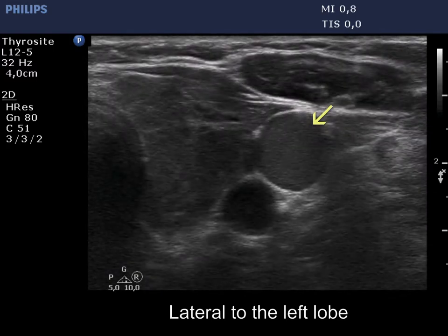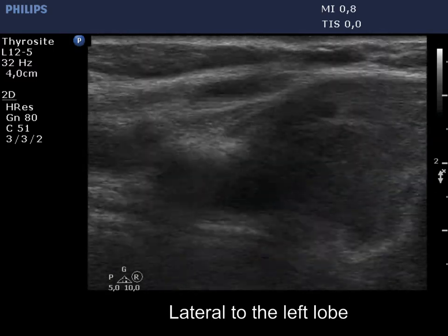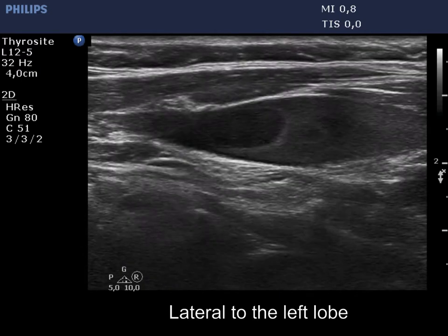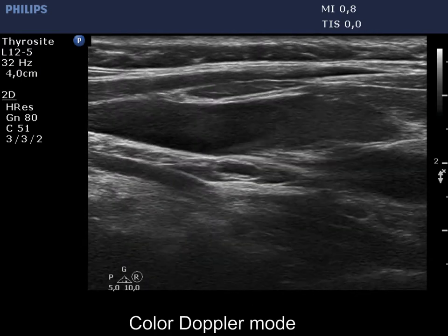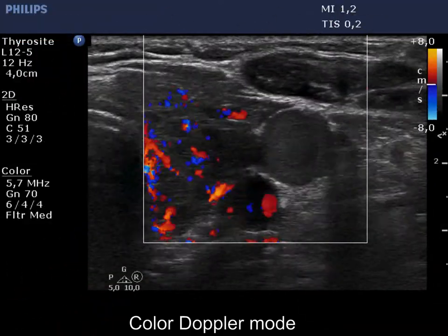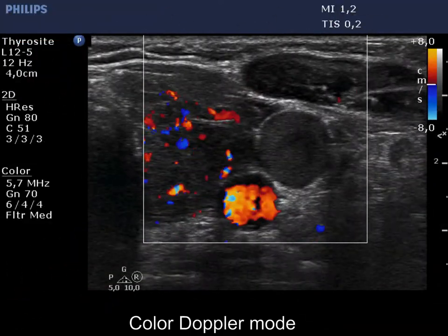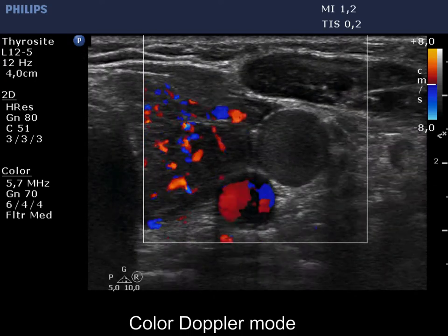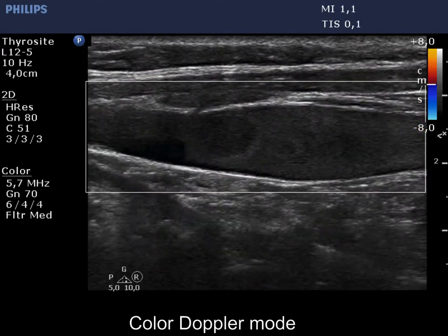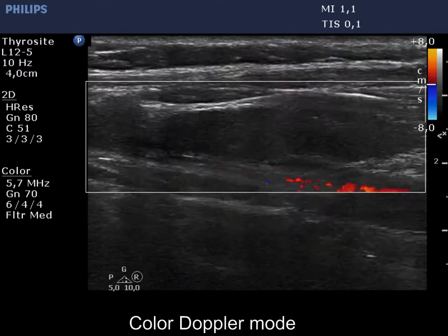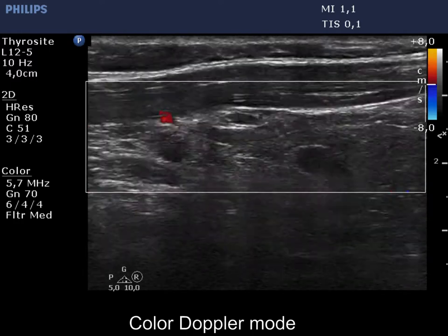The ventral vessel, the jugular vein, is occluded. Most parts of the vein are filled with clot. There is no vascularity within the vein. Even those portions of the vessel — the more hypoechoic fields which are not occupied by clot — present no vascular signal.